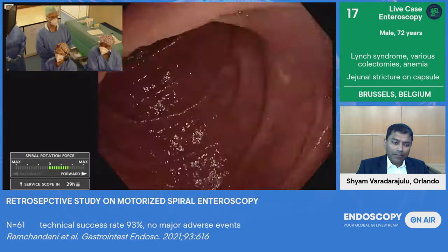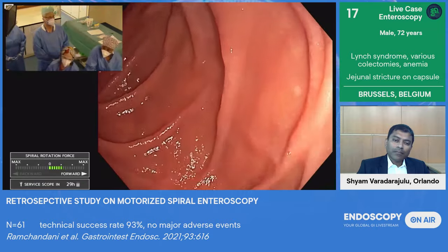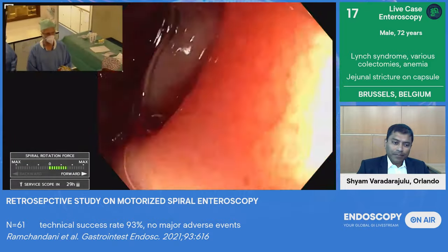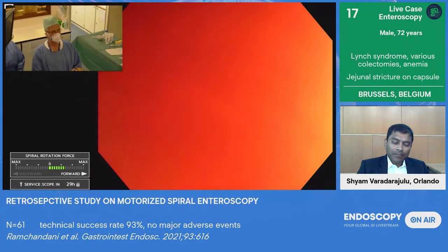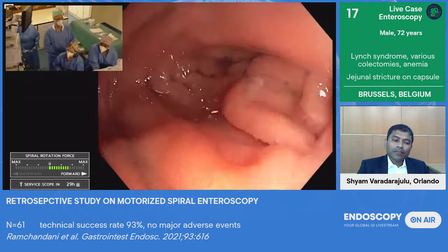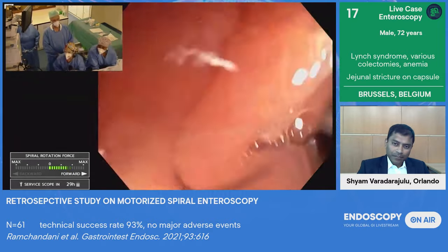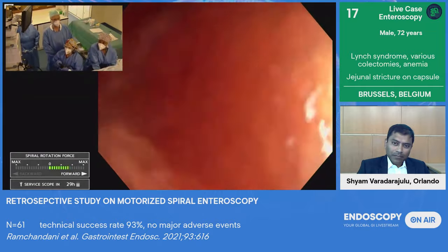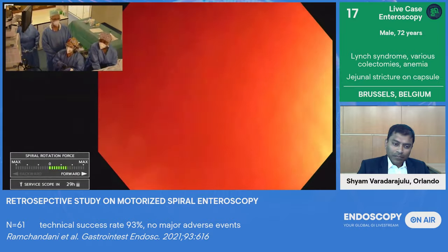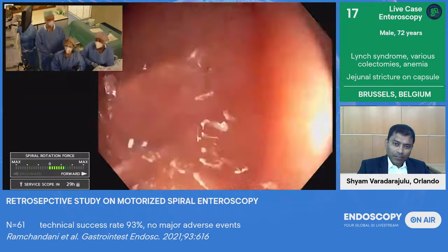The problem is that when you have a Roux-en-Y anatomy, of course, you have to choose the right loop. But sometimes you may be stuck at the level of the anastomosis because this part is fixed. And of course, we are always very careful with these patients. We would like to avoid complications. And so I would say that in our hands, the success of reaching the second part of the duodenum in Roux-en-Y anatomy is approximately 60%. 6 out of 10, which is probably not so impressive, but we are still learning and we are also rapidly moving to another approach since we also do the percutaneous approach ourselves. So this is still ongoing, but you're right, this is a possible indication.